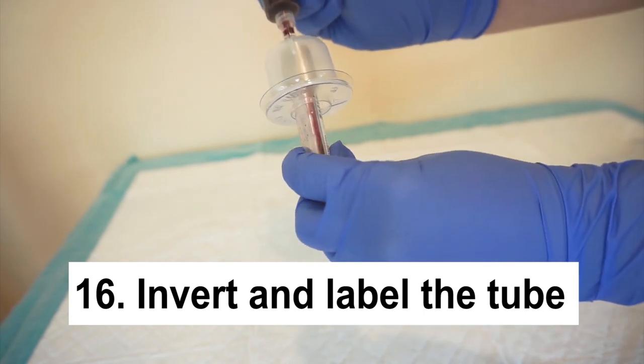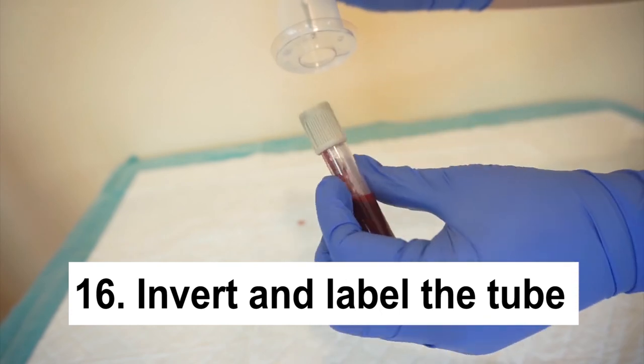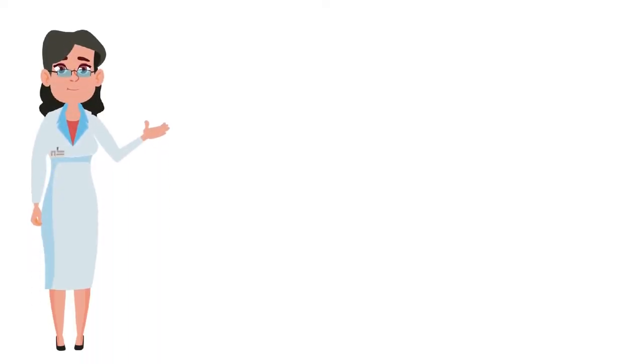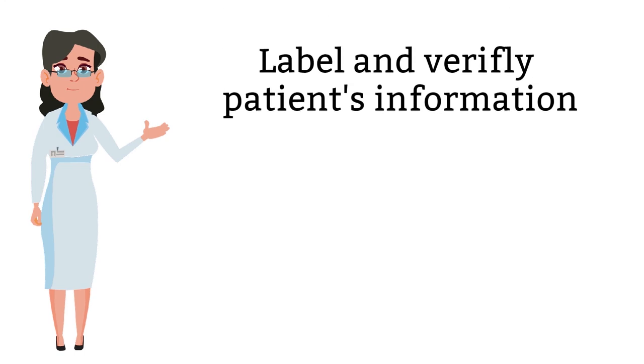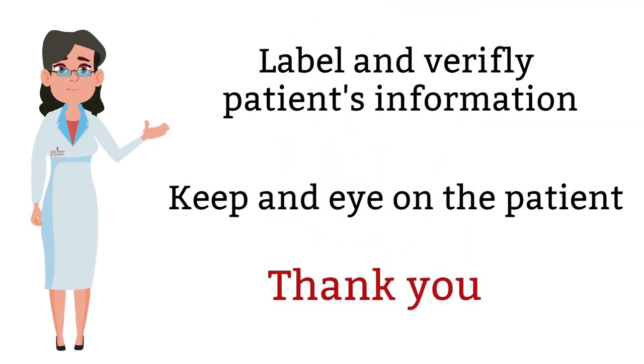Sixteen, invert the tubes a few times and label the tubes in front of the patient. Generally, on the label, you will include your initials, date, and time of draw. As soon as you are done labeling the tubes, let the patient take a look and verify that it is correct information. While you are doing this, you will also keep an eye on the patient. Make sure that the patient is doing okay and not fainting. Seventeen, you then thank the patient for his or her cooperation and exit or let the patient go.